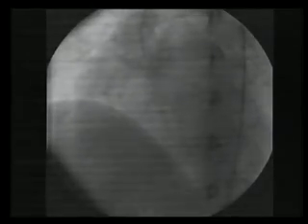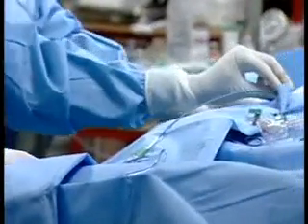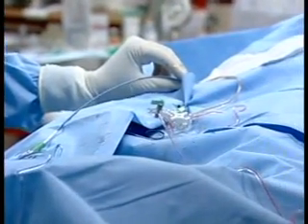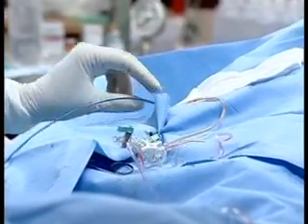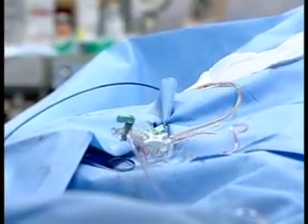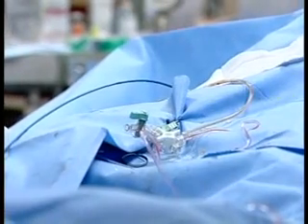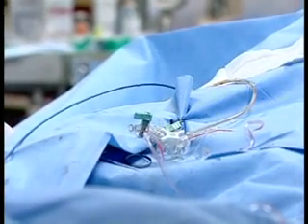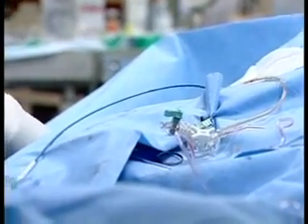I just want to show you what we have done. This is a 6 French guiding catheter and we have taken an angulated glide wire here. And then we keep the guiding catheter at the sinotubular junction. We don't cross into the LV and then cannulate the VSD. That may injure the ventricular septal defect or conduction system. So we keep the guiding catheter there, float the glide wire in the LV, and scratch around. Please go to the next slide. So you can see the scene here.